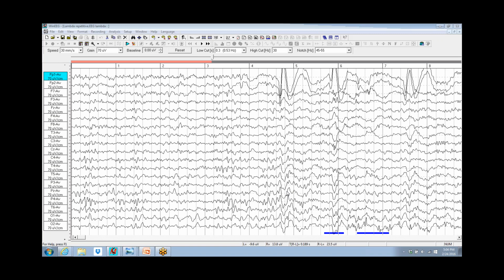If you look at the response to an individual stimulus, it's a tiny signal, embedded on top of all the EEG chaos, and you don't see the individual responses. But the EEG is full of event-related potentials, the brain responding to sensory inputs.